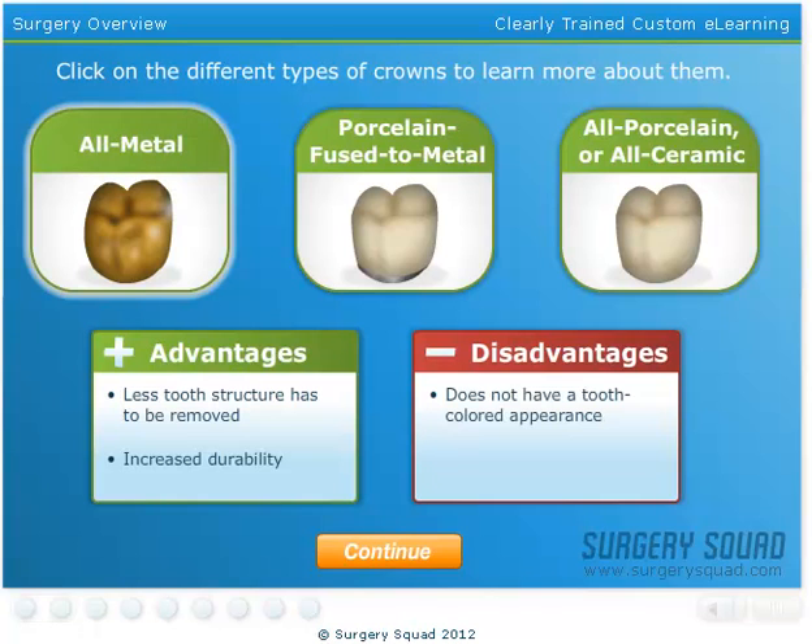The metals used in all-metal crowns include gold, palladium, nickel, or chromium alloys. While all-metal crowns require less tooth structure to be removed and have increased durability, they don't have a tooth-colored appearance.